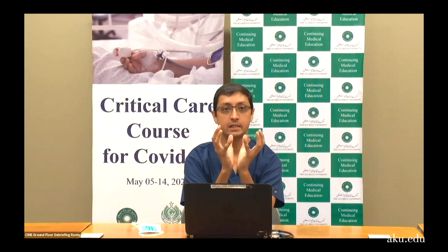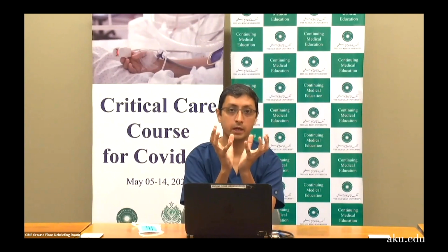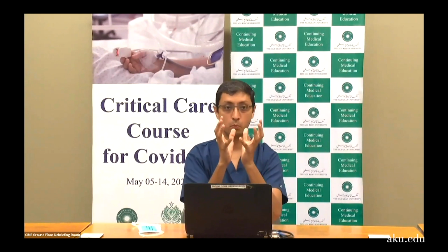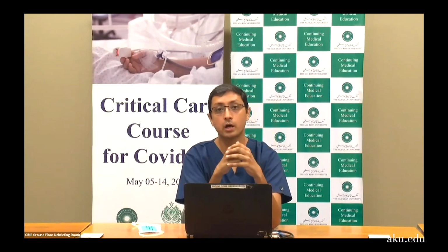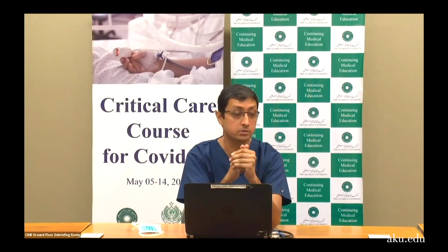So basically, PEEP gives additional pressure at the end of expiration, keeps the alveoli open, and helps with oxygenation by preventing the collapse of the alveoli. A higher PEEP is going to put more pressure on the alveoli and keep them more expanded and increase the intra-alveolar pressure, which helps with oxygenation as well. I hope that answers the question.